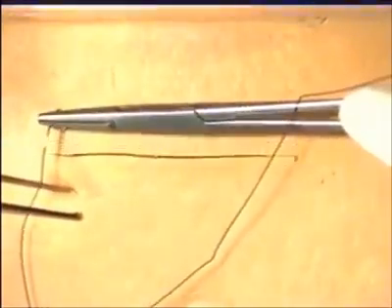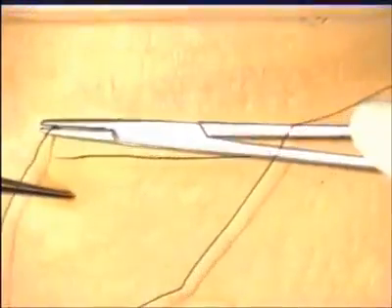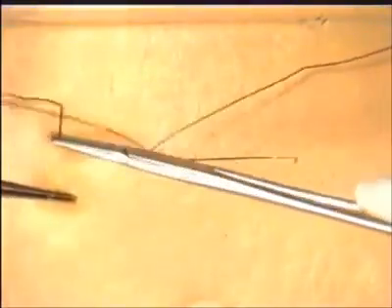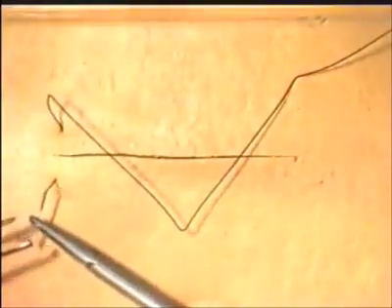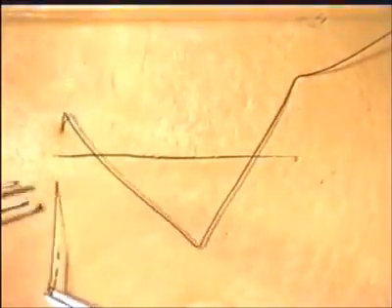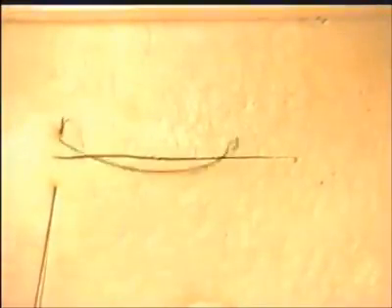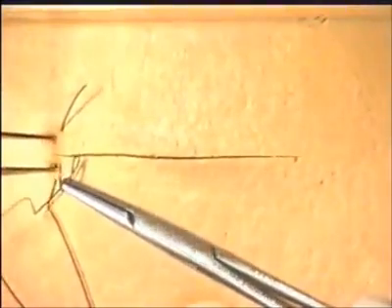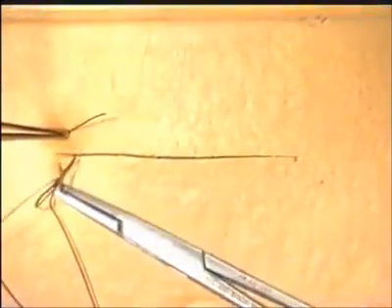Mattress sutures can be inserted to allow for eversion or inversion. They can also be used for irregular skin edges. We will demonstrate here a vertical mattress suture. The suture is put in, as you see, in the standard manner. The needle is reversed, and then, taking just a small bite of the skin edges, the suture is completed and a reef knot tied.